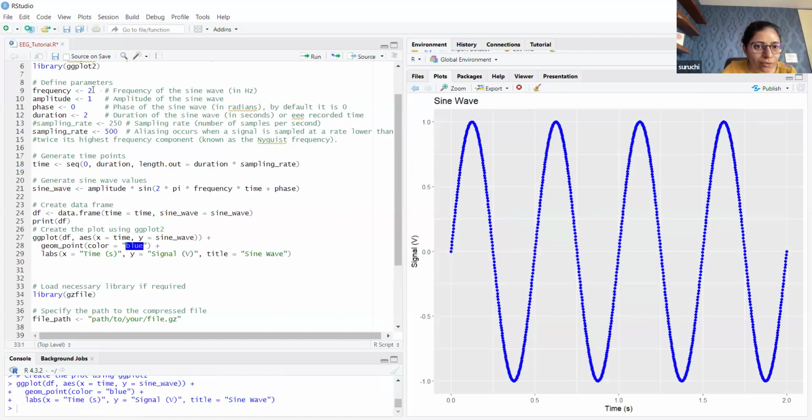Now you have a phase of 0, right? Yes. Make it pi by 2. How to do it? So you have this pi, right? Yeah, it is pi. So just pi divided by 2.0. In the phase upper you have phase, right? Yeah. Here, instead of 0, make it pi by 2. Here I should put pi by 2.